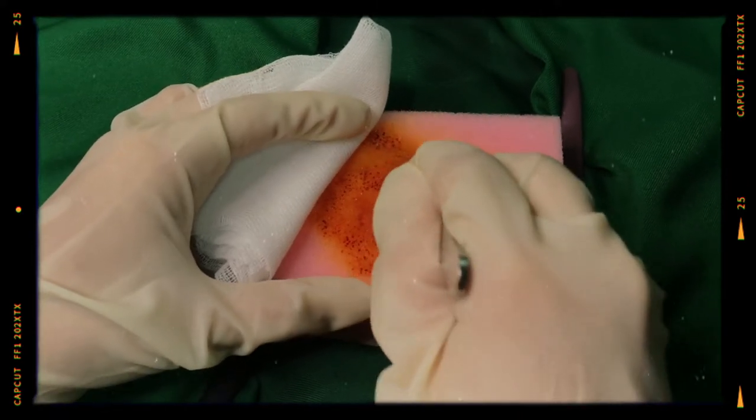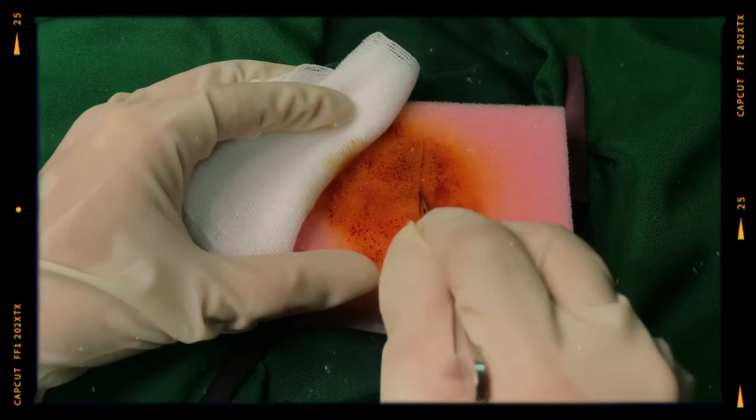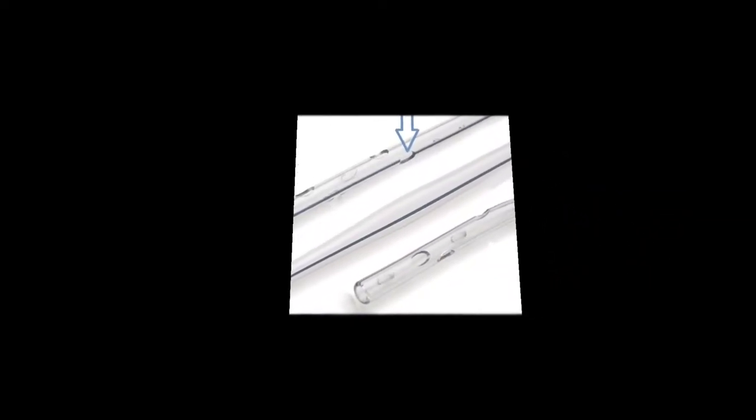Make a 2.5 to 3 cm long skin incision parallel to the axis of the ribs and well into the subcutaneous tissue. Measure how far the chest tube is to be advanced after placement.